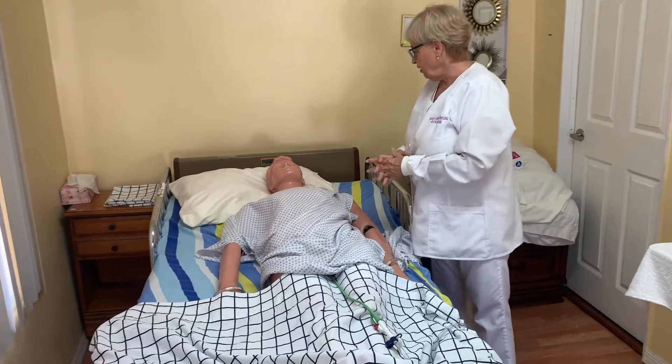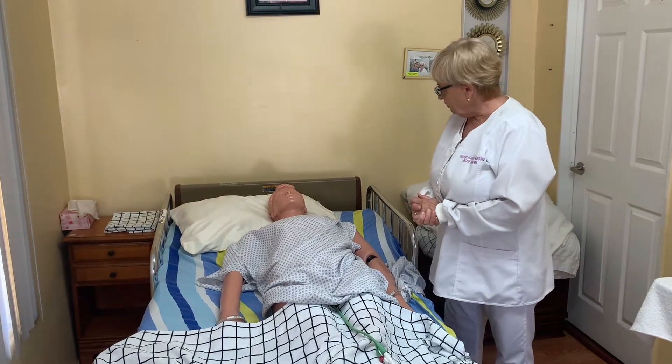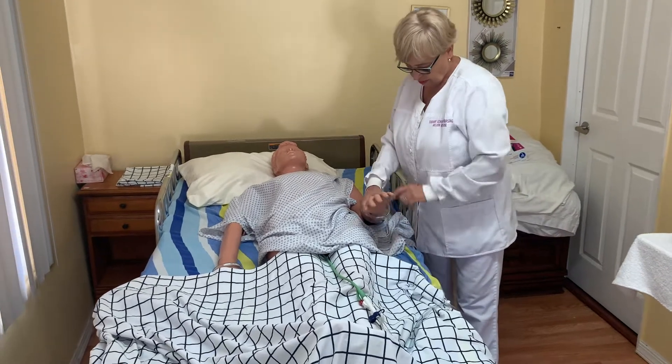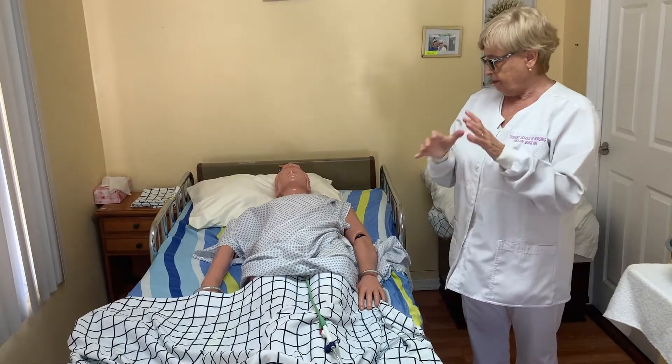Good morning, my name is Helen. I will be your CNA student for today. I'm going to assist you with an indwelling catheter or Foley catheter care. Is that okay with you, Mrs. Green? I'm going to bring my supplies, wash my hands, and I'll be right back.